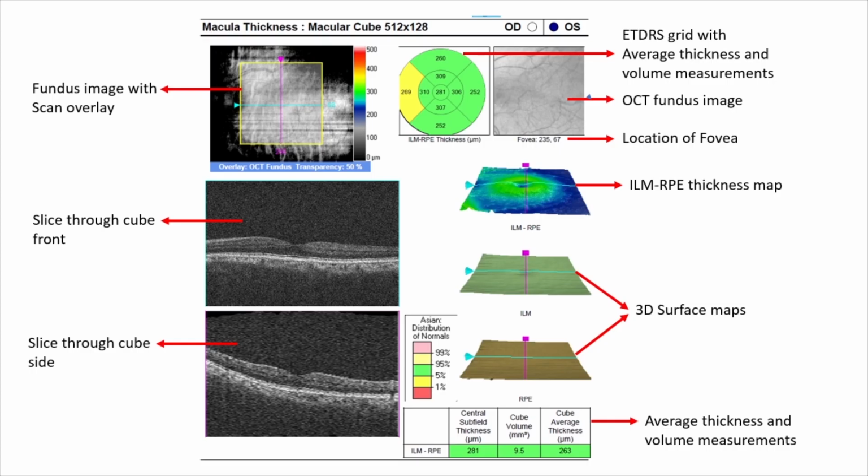Yeah, I just have one more question. Go back. You have green, you have yellow, you have pink. When they say normative data, what all are the parameters you need to have normative data? To say it is normative data, what all do you take into consideration? You say, I'm doing normative data for this machine, I'm doing my normative data for that, and based on that, I have given this. So what are all the parameters one needs to consider when you establish normative data?